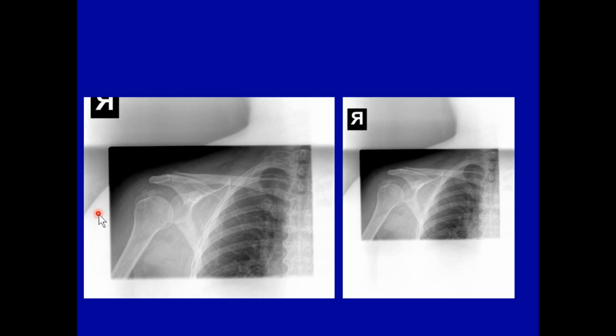That's unavoidable because if you stand your patient and put them in the middle of your digital receptor, all of these little pixels and dots, black dots that we talked about in the previous sessions, get exposed. And the only thing you have available to you is to collimate well. Now, if we wanted to take this to the next level, we could put a lead strip that would avoid the exposure to the neck, but minimal exposure to the neck isn't a problem, but you know how important it is and how strongly I feel about not exposing breast tissue unless you absolutely have to.